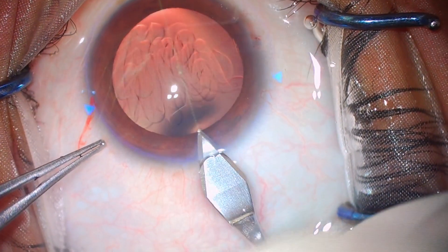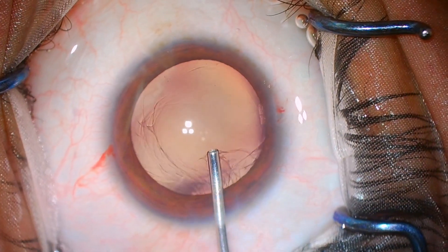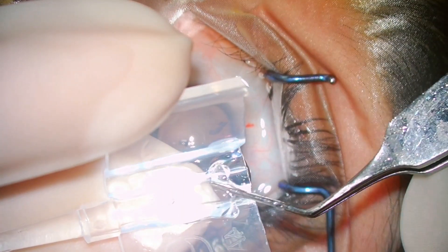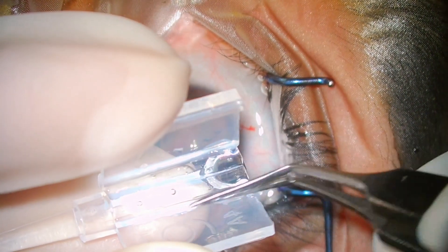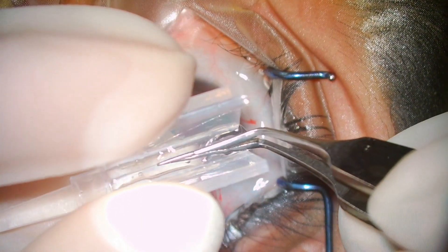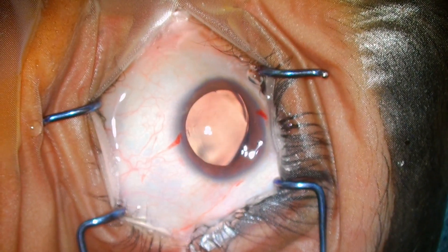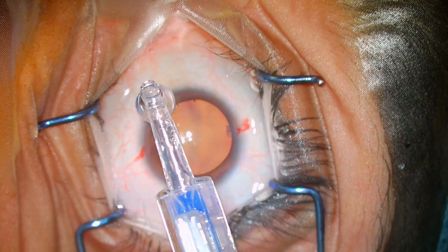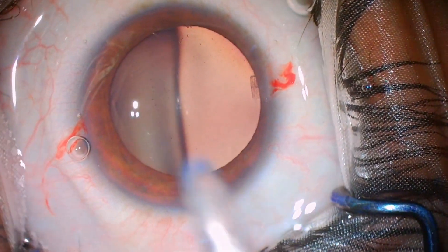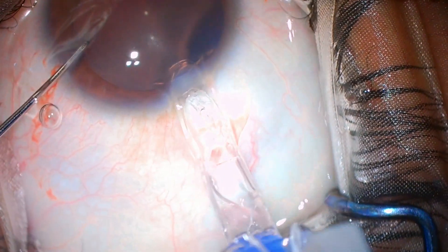This is the technique that I use: a larger side incision and then a main incision of 2.8 mm. I slightly enlarge the inner part of the incision for easy injection of the IOL. This IPCL is a hydrophilic IOL, so it is very easy to implant. You just have to make sure that all the IOL and its haptics are in the groove and there is free movement before you are ready to inject.